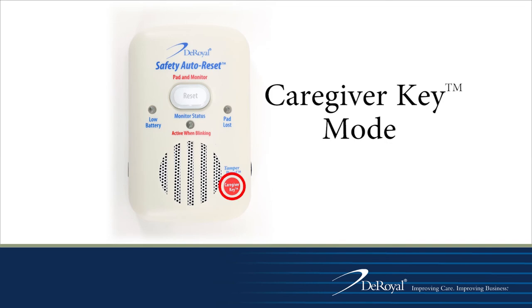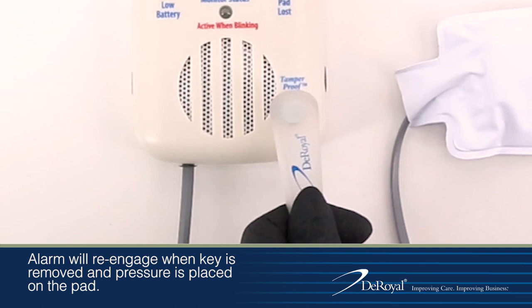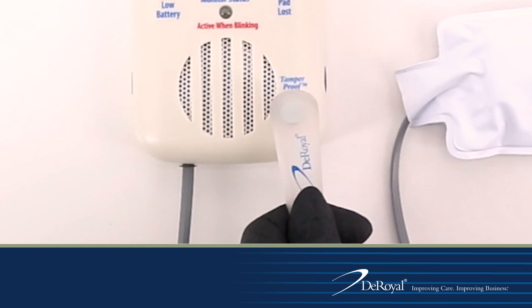Caregivers may make the monitor tamper resistant by switching it to caregiver key mode. In caregiver key mode, the reset button is disabled and only the caregiver can reset an alarming monitor with the caregiver key. This helps to ensure patients and visitors cannot disengage the alarm.